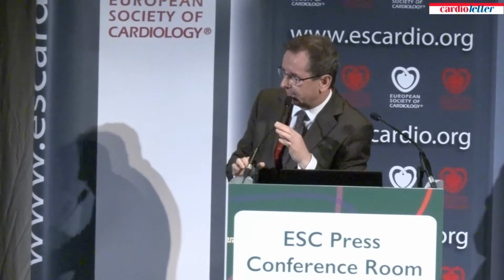You can stent the main branch first, or you can stent first the lesion from the main branch into the side branch, do kissing balloon for the distal part of the main branch, and then it's a decision. If you have good results, you can leave it. If you have dissection or residual stenosis of more than 75%, then you can put 1 stent more. And then final kissing balloon dilatation is obligatory. So that's why, Andreas, you mentioned this correctly, we are a high volume center, and we do this routinely in 100% of cases. Yeah, which is good.